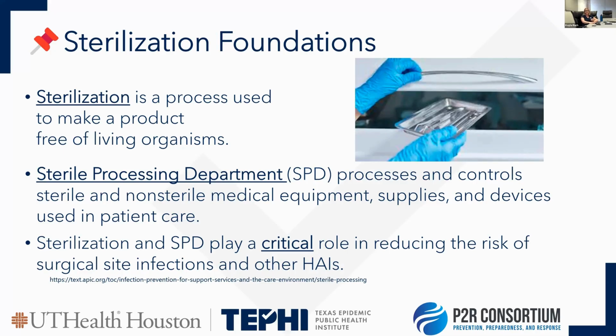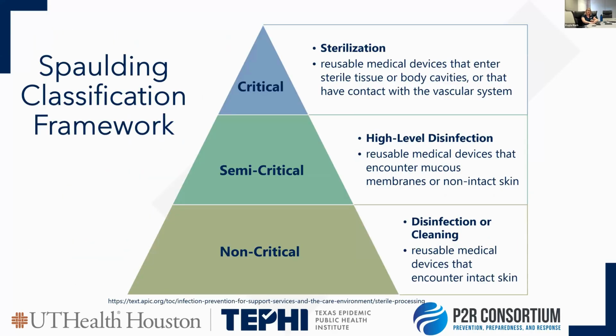Anytime that you have a spike in your surgical site infections, or your SSIs, it's a really good thing to be mindful about the processes of sterilization and check with SPD that no process has changed. There hasn't been any equipment failures when you're doing some of your case workups to see if the root cause of the SSI has been due to a failure in sterilization practices.